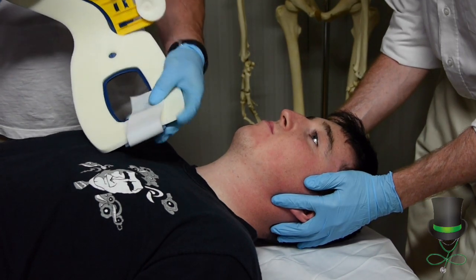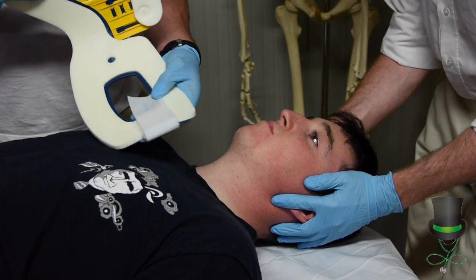Keep the velcro in and fold it over onto the collar like that to prevent it from being dragged through dirt.